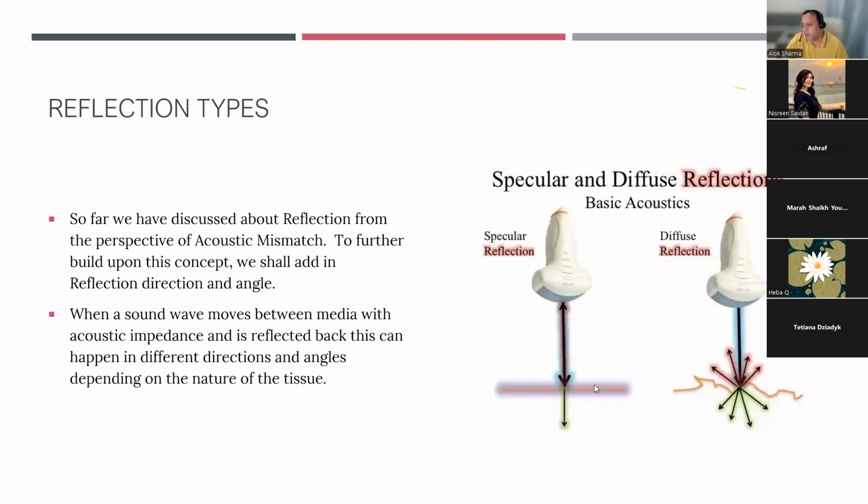So normal pleura with A lines, the pleura appears bright and you get reverberation artifact. But if you've got a pneumonia with atelectasis, then you might find that actually you don't see a bright pleura. If there's complete atelectasis, you don't see the pleura at all. And what you see is liver-like tissue, as opposed to seeing reverberation artifact. So diffuse reflection commonly occurs in situations where you've got bad consolidation pneumonia.